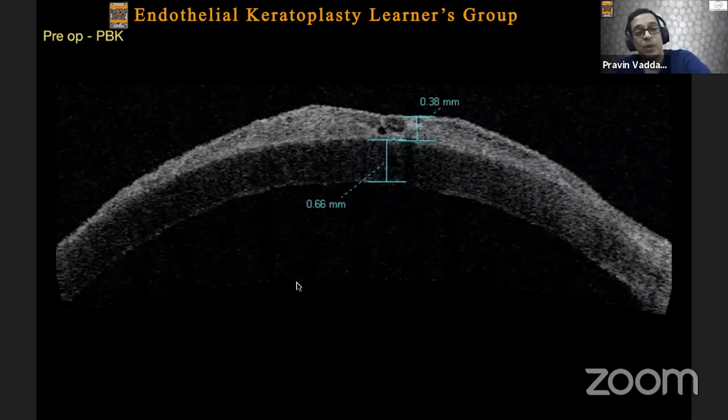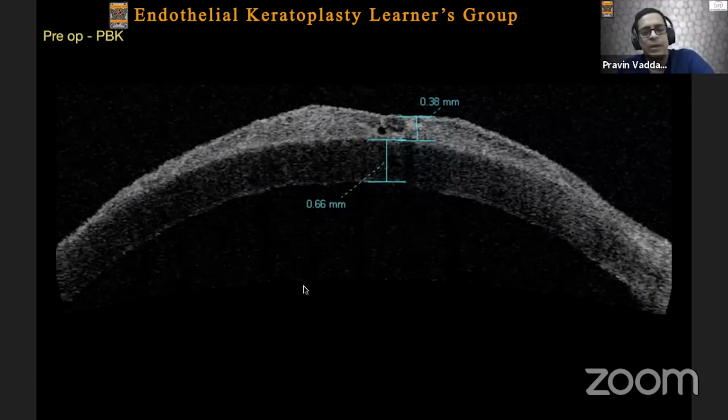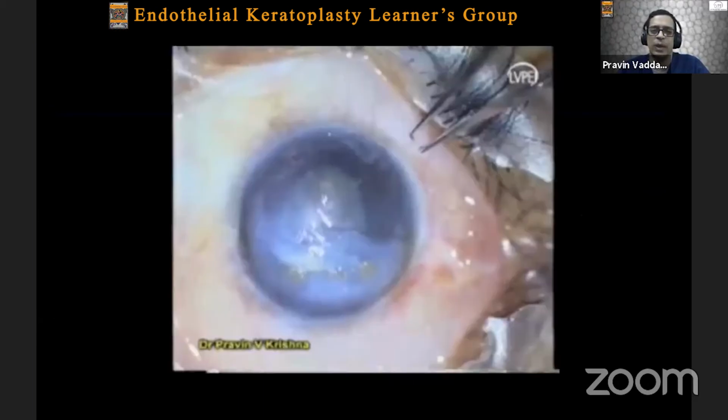And the OCT is again very crucial to make a decision whether you should do a full thickness penetrating keratoplasty or only an endothelial keratoplasty. Because if you have a very good cleavage plane, the majority of these patients do really well by taking off this subepithelial fibrosis and the epithelium. And this is the same patient 3 months post-operatively, and you'll see that the cornea has cleared really nicely. The cornea, this is post-DSEK, has deswelled quite nicely as well. So you don't need to worry about subepithelial fibrosis as long as you get an OCT and you know that there is not significant scarring in the anterior stroma, and you will get a good result.